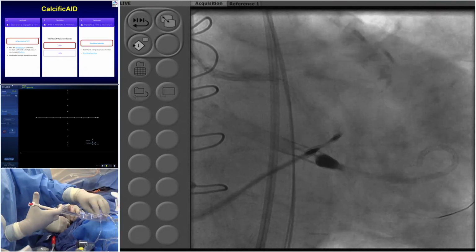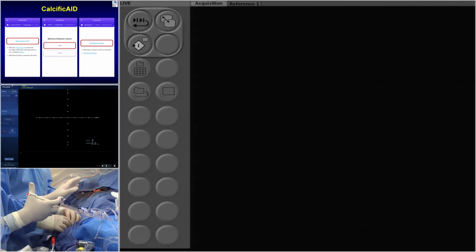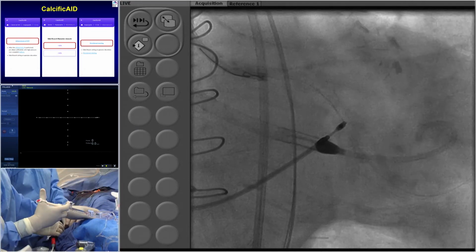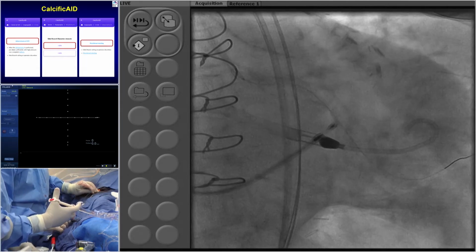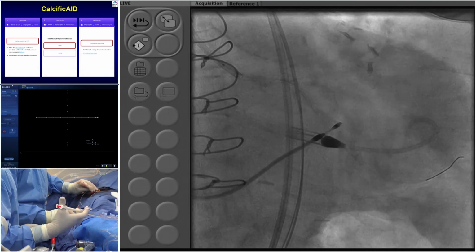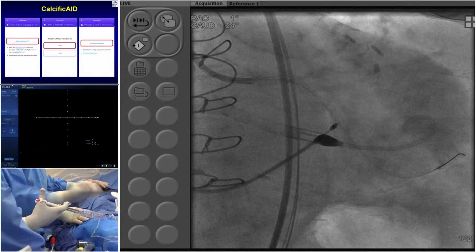Guide a little bit out. Yeah. Good. That's fine. Okay. Ready? Guide has to be a little bit out. Yeah, Laura. Okay. Not so much out. Yeah, that's a little too much out. The same thing that is really jumping. Now, good. That's good. Okay.